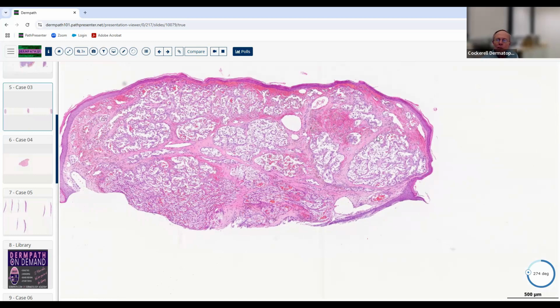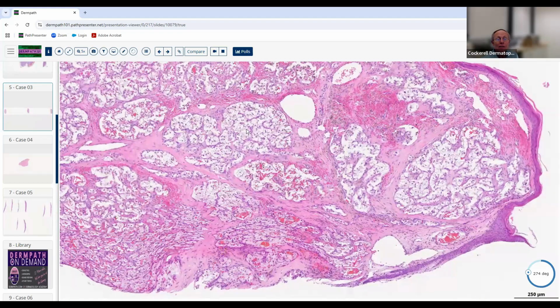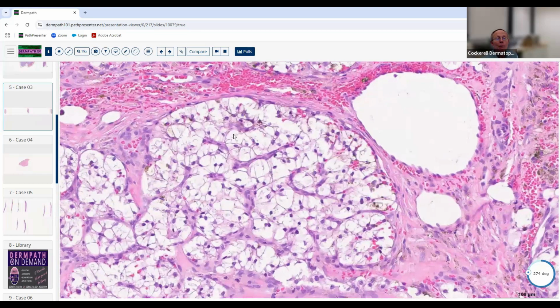And now if you start looking at this, you see that there are these nodular aggregations, like I said before, comprising this. So it's multiple little nodular aggregations together, forming one large aggregation here, or one little papule. And as we go to highest magnification, we now see that these cells have this markedly clear staining cytoplasm with these round nuclei. They don't really have the gossamer, starry appearance that we see, for example, in a sebocyte. They've got this round nucleus, but they do have these small strands of material, which is probably nucleoplasm and maybe some cytoplasm within the cells.